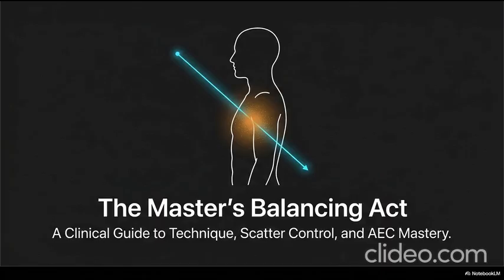But the golden rule of this system is that AEC is only as smart as the radiographer's positioning. Because the machine is blind. Completely blind. It doesn't know what anatomy it is looking at. It only measures the radiation hitting those specific rectangular chambers. Okay, so picture the internal anatomy positioned over the digital detector. If you are imaging a lumbar spine, you must manually select the center ionization chamber on the console and position the patient's spine perfectly over that center rectangle.